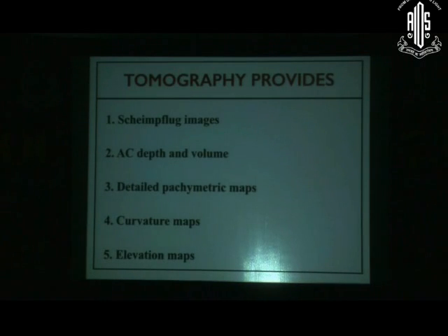So tomography is providing us with Scheimpflug images. They also give us the AC depth as we saw in the images. Even the volume is calculated. It gives us detailed pachymetric maps because the anterior surface and posterior surface are also demarcated.